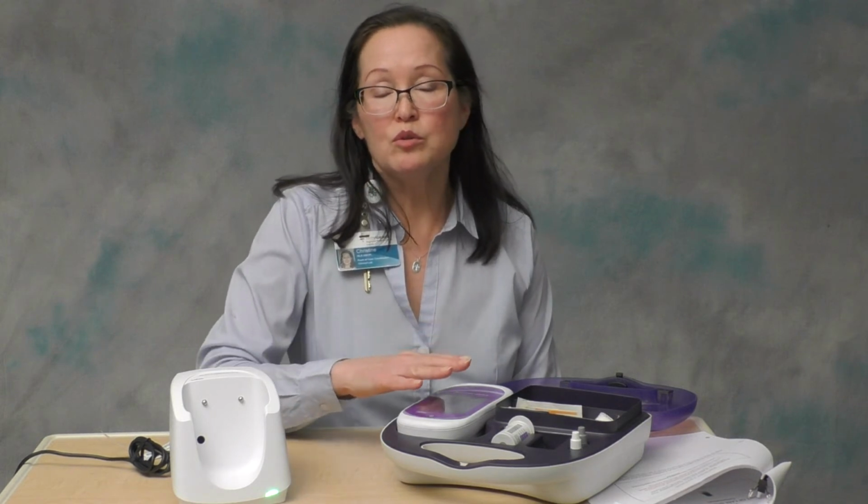This is going to include patients that have severe dehydration, hypovolemic shock, significant peripheral edema, or if they are on induced hypothermia protocols, you don't want to do capillary testing on them. Now you can still use the glucose meter on those patients. You just need to make sure that your sample type is either a venipuncture or a line draw. So for all practical purposes, since you don't have a mechanism of getting a drop of blood out of a venipuncture tube, you can use a line drawn sample on patients that have impaired peripheral circulation.